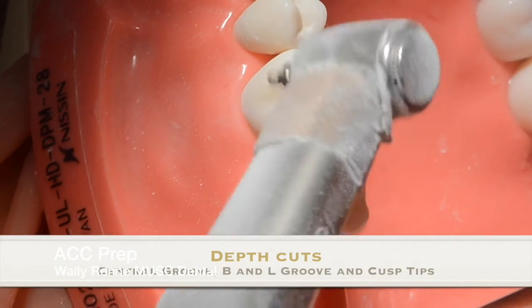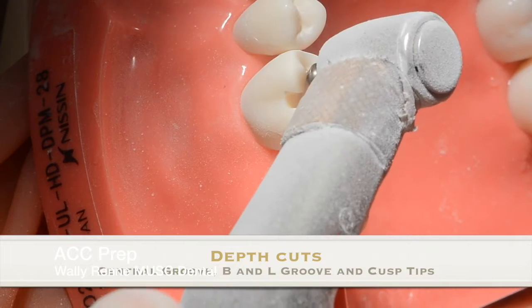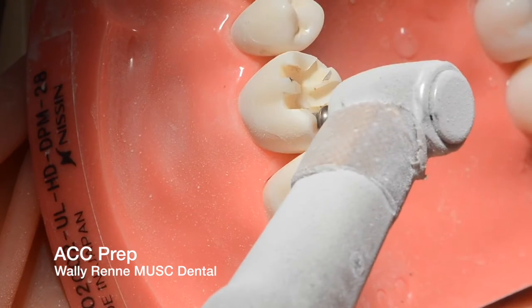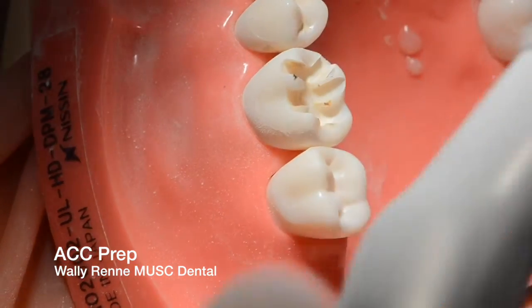These burs bottom out — they're essentially idiot-proof. You're just going to go in the central groove and bury that all the way down to the hub, then go up the buccal-lingual grooves and then the transverse ridges of all the cusps so that you make sure you get those properly reduced.